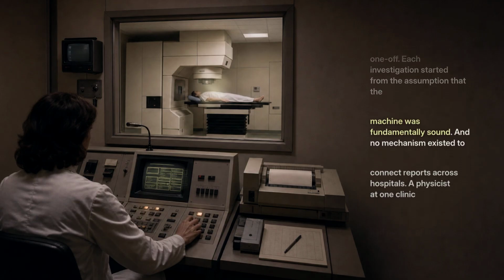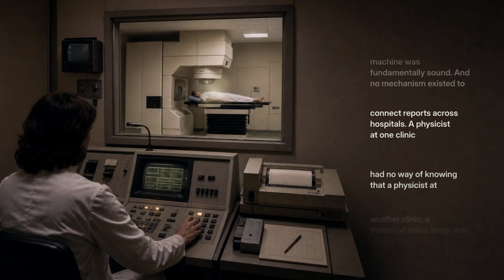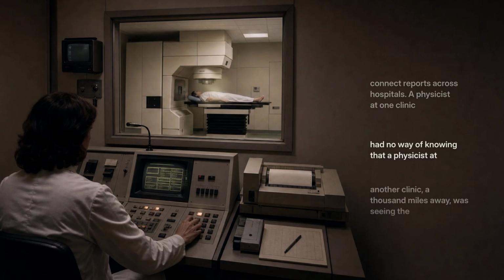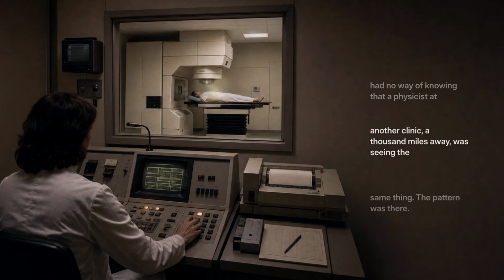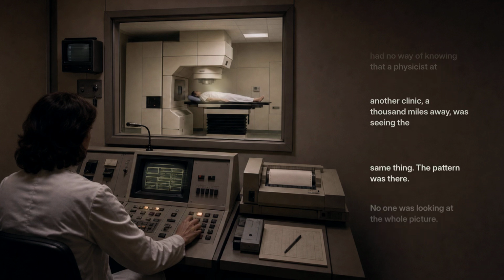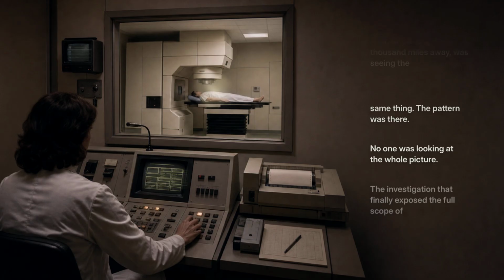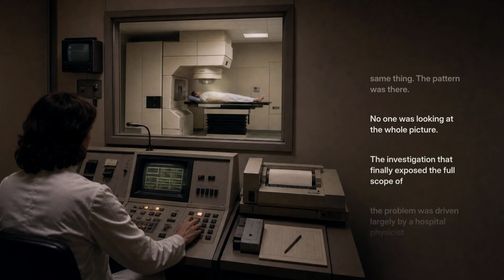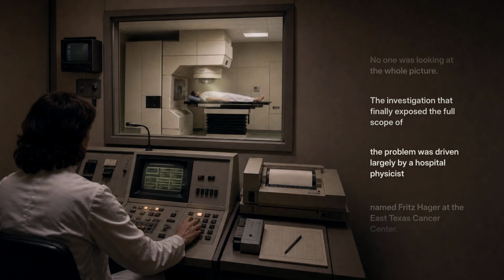Each incident was handled as a one-off. Each investigation started from the assumption that the machine was fundamentally sound, and no mechanism existed to connect reports across hospitals. A physicist at one clinic had no way of knowing that a physicist at another clinic, 1,000 miles away, was seeing the same thing. The pattern was there. No one was looking at the whole picture.